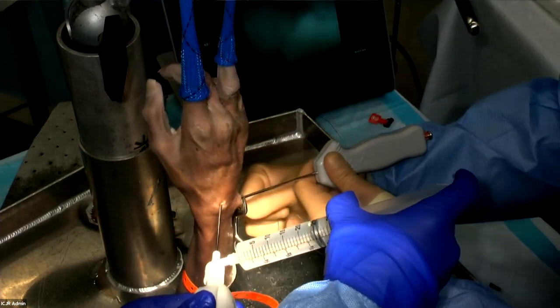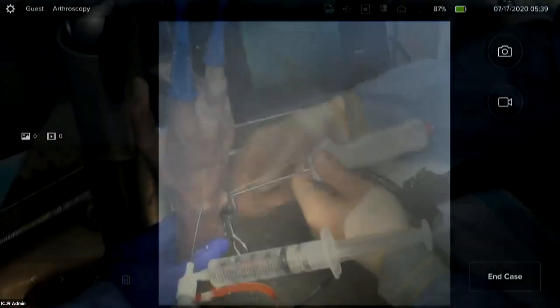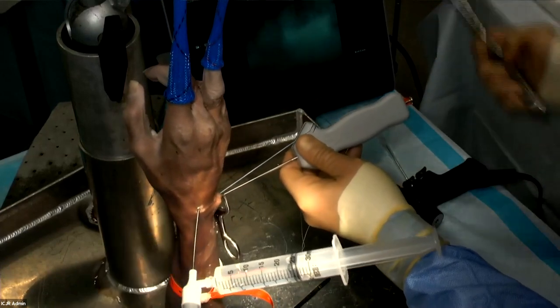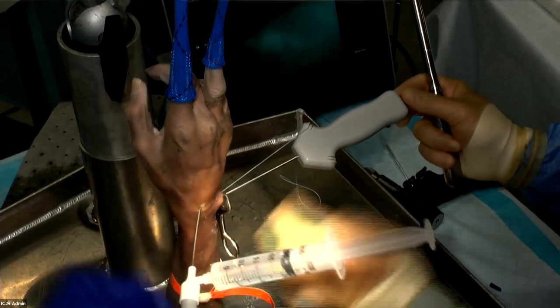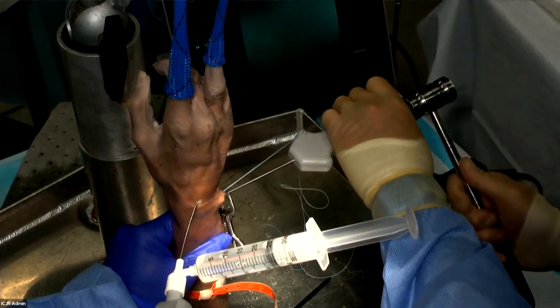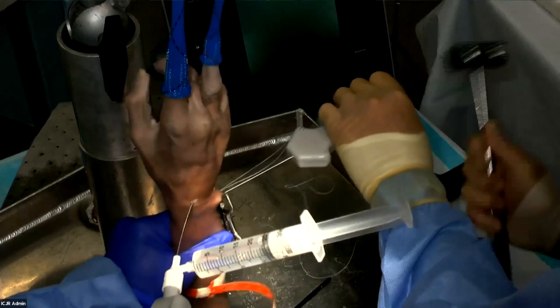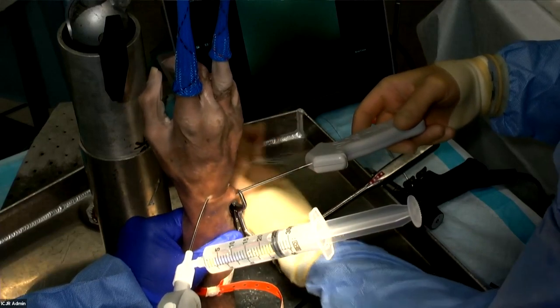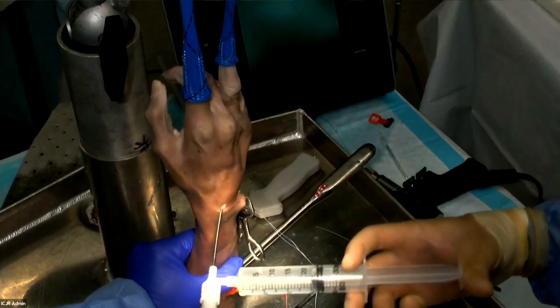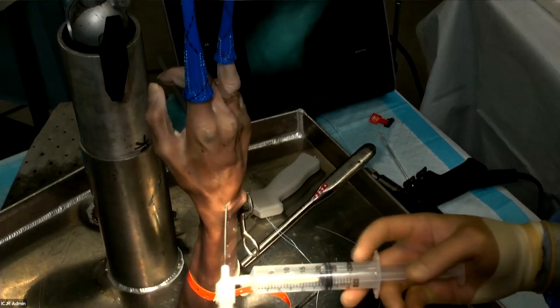I'm going to tension the sutures one at a time and cleat them onto the suture anchor, then impact it — give me a little counterforce on the forearm, thanks. Once the anchor is down to the bone, take the orange plastic off and seat the anchor the rest of the way. There we go — the TFC is now tensioned back down to the ulnar fovea.